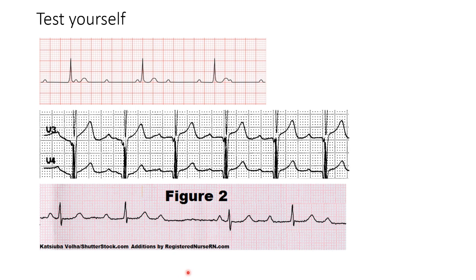Okay, so now this is a small test. You can pause the video here and test yourself, and then I'll discuss the answers on the next slide.